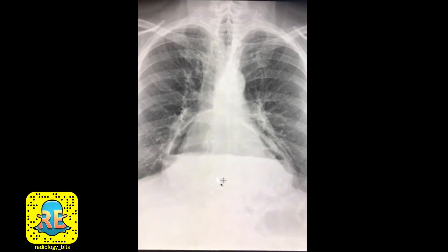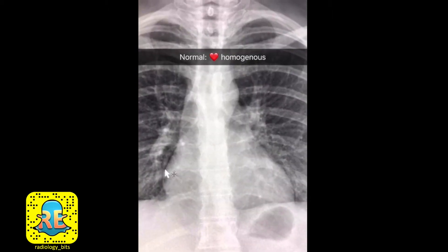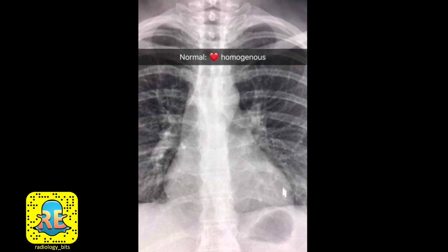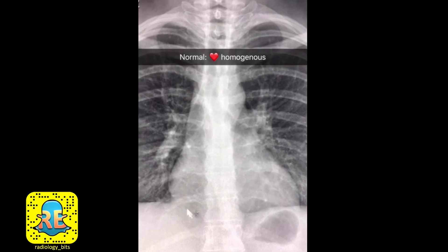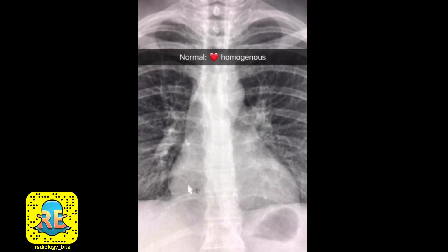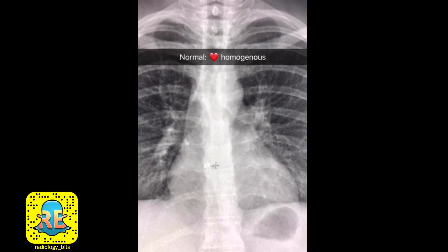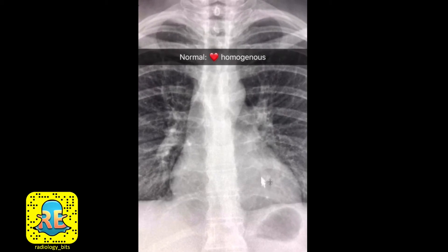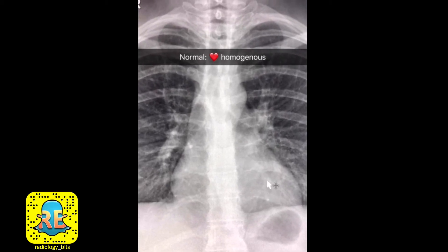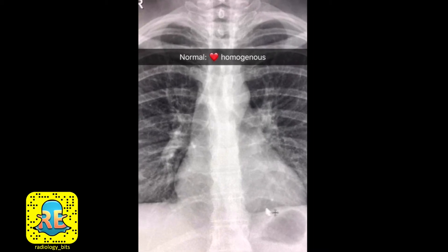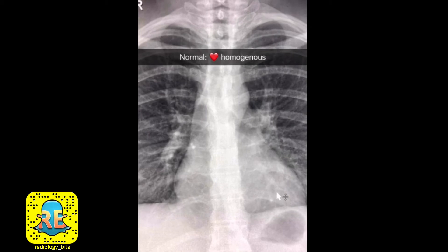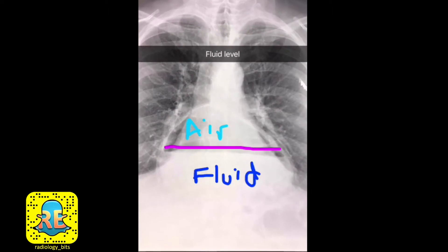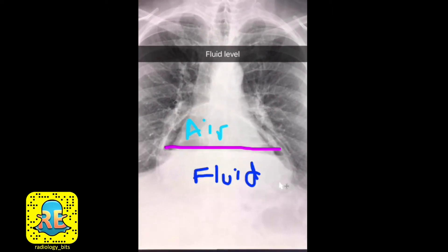Before that, let's go to a normal case quickly. This is a different normal case. The area we're looking at is the cardiac silhouette. This cardiac shadow should be homogeneous and the border should be very well defined. You might see some inhomogeneous densities related to tubular branching structures, which are normal vasculature of the lungs seen behind the heart. Other than that, the heart appearance seems homogeneous.